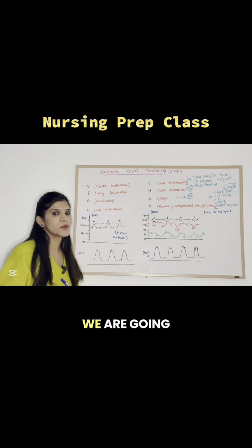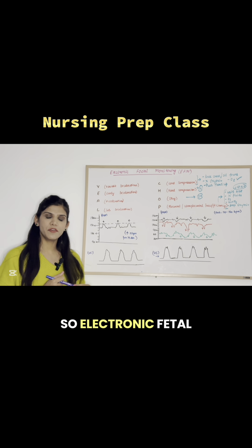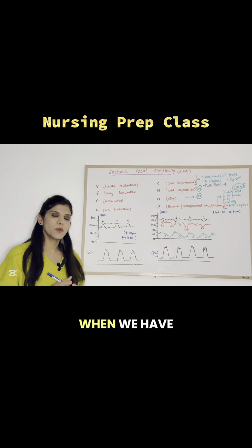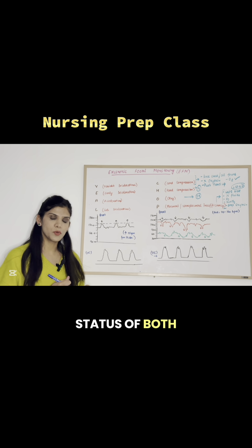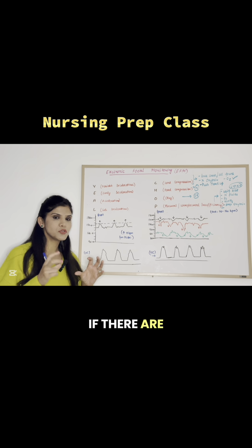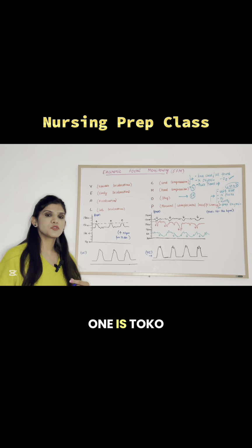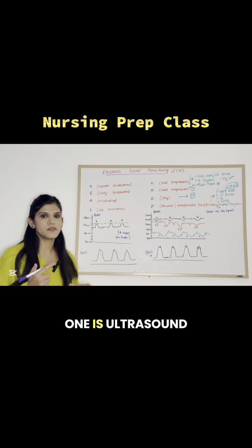In this video, we are going to discuss electronic fetal monitoring, EFM. Electronic fetal monitoring is done when we have to detect the status of both mother and baby during labor. In this case, there are two devices applied onto the mother's stomach. One is a tocotransducer and another one is an ultrasound machine.